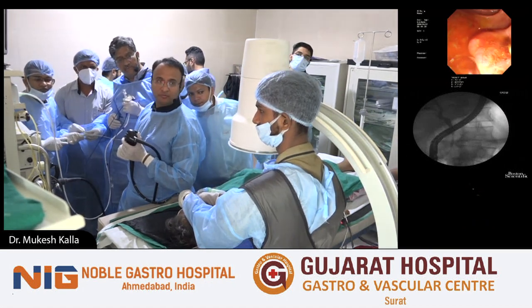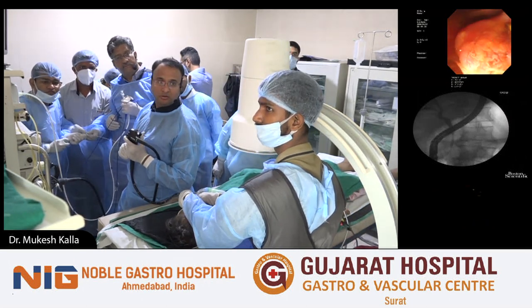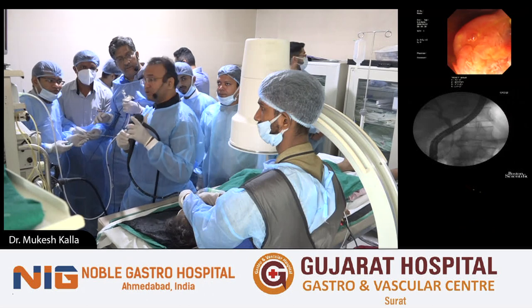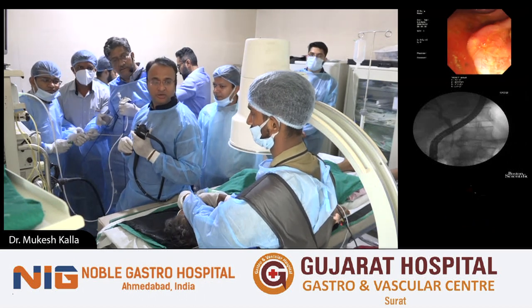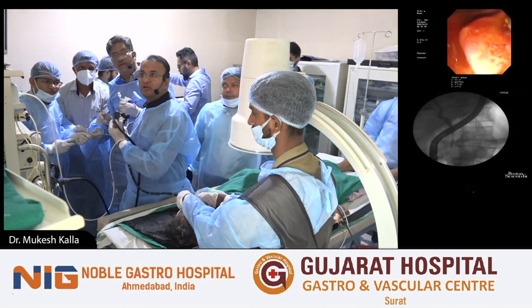That surgical field will be full of adhesions. So in my personal thought, I will always ask my colleague first whether you can remove it through ERCP, you try or attempt, or at least you put an endobiliary stent. If he's not able to succeed, then with this backup, I'll go inside and remove the cystic duct. I might have to open the CBD also, but I'm very confident that I can suture it back since the stent is already in situ. This would be my approach.